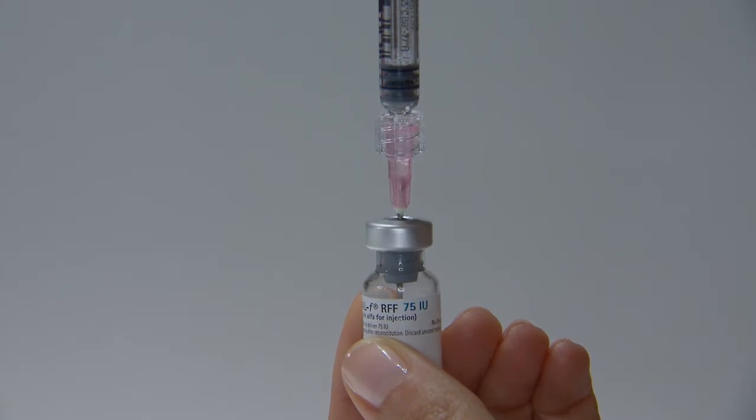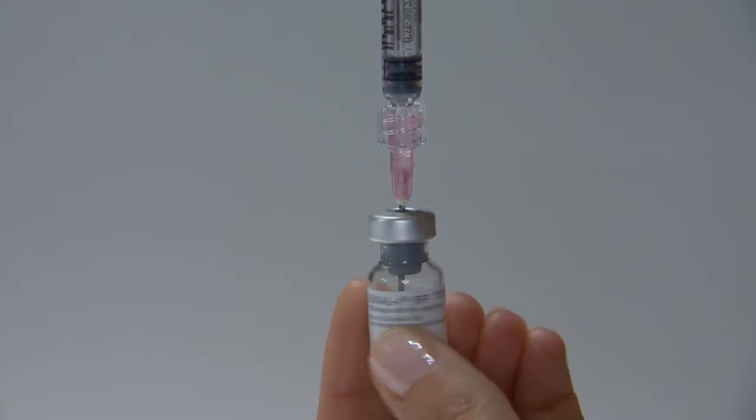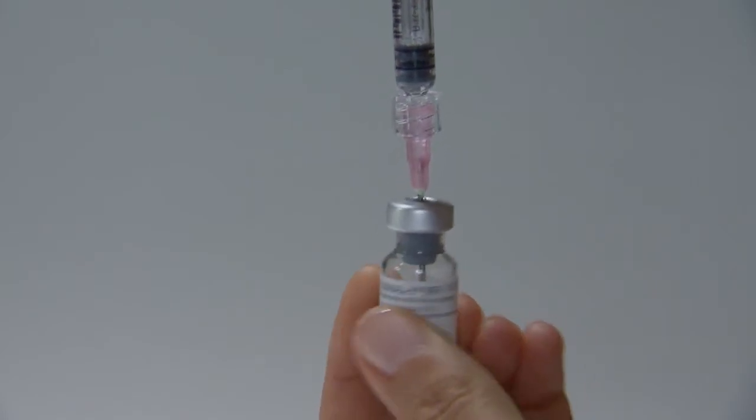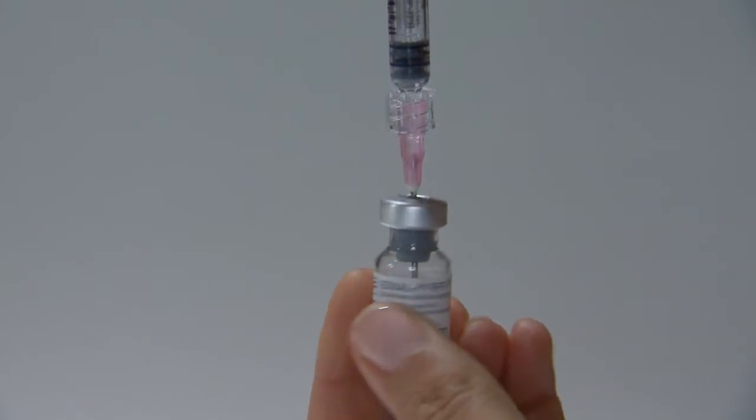Gently rotate the vial between your fingers until the powder is dissolved. Do not shake the vial. If bubbles appear, wait a few moments for the bubbles to settle. The liquid drug should be clear.